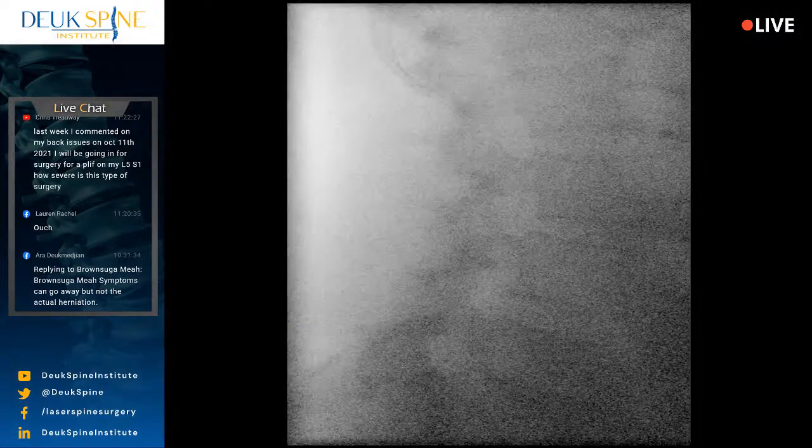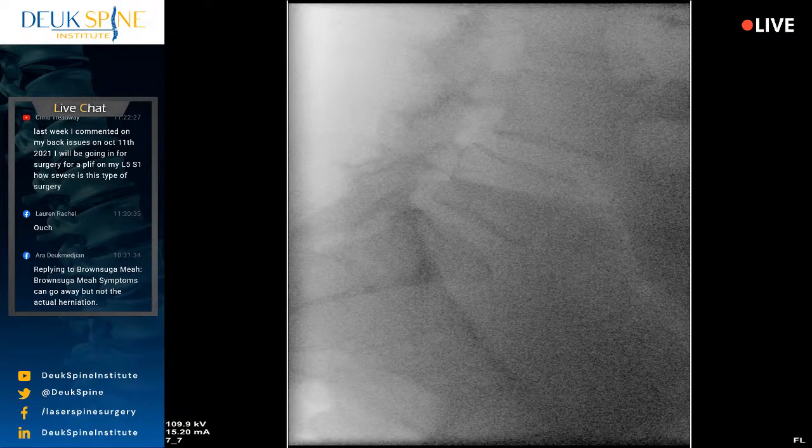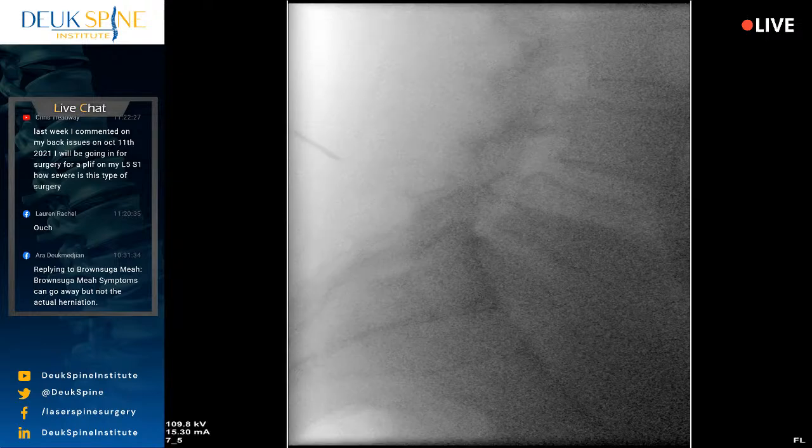So just to review once again, we have a herniated disc at L5-S1, left side. It's in the neuroforamen, pushing on the nerve root called the L5 nerve root. All right, that's much better. Let's see if we could maybe drop the table. I'd bring the fluoro north by 1/2 inch. I'd drop the table possibly 1/2 inch. Let's go. Fluoro north 1/2 inch. Did you do it? Shot? All right, let's try to keep that.